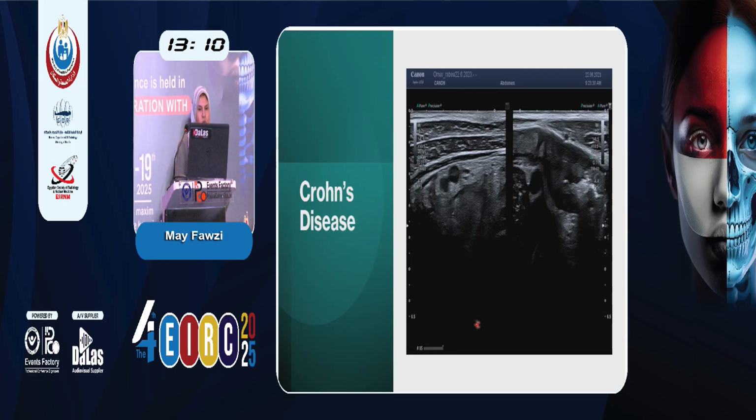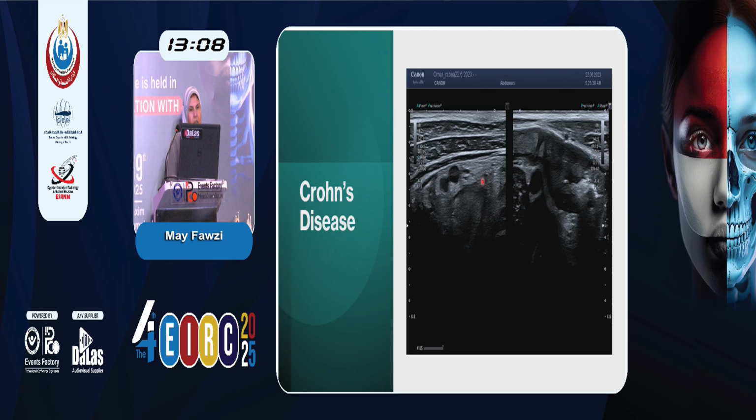This is another patient with Crohn's disease, and as you can see, another pointer to the presence of inflammation is mesenteric fat hypertrophy. I have 2 lymph nodes. Both lymph nodes do not appear well. They are roundish instead of oval. They don't have a hilum, which is how we diagnose a normal lymph node by ultrasound, and they are surrounded by a lot of mesenteric fat hypertrophy.